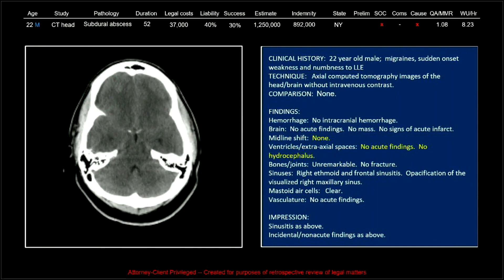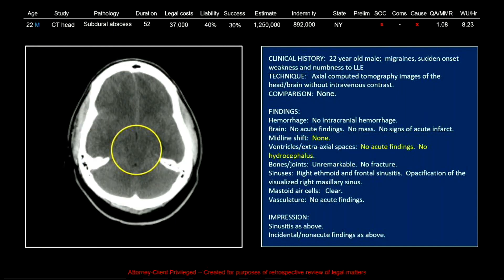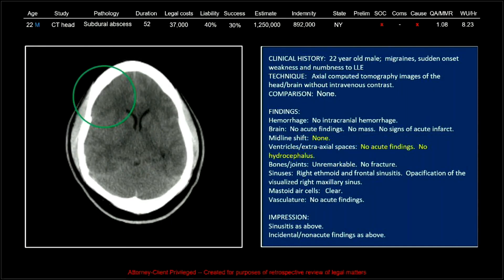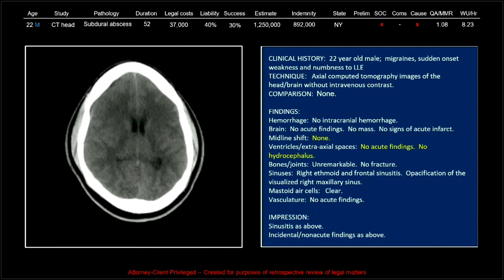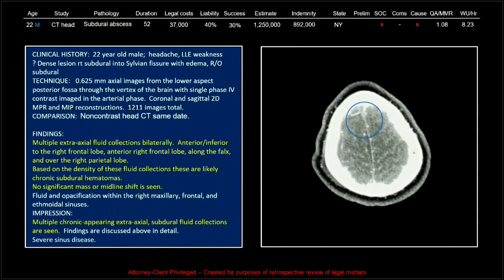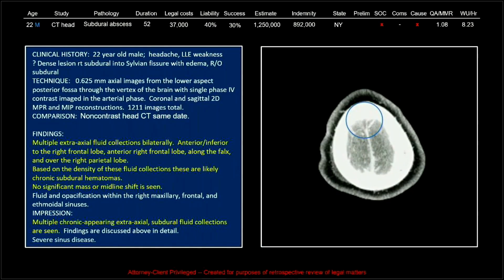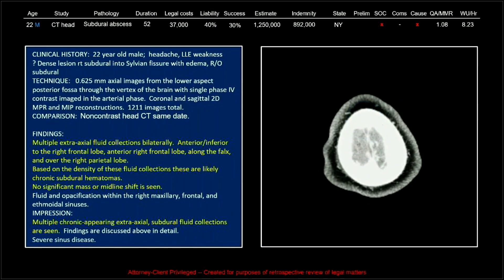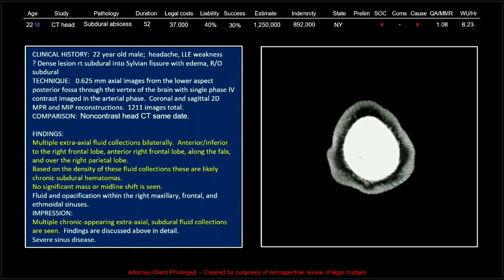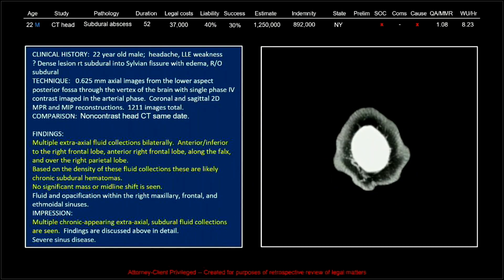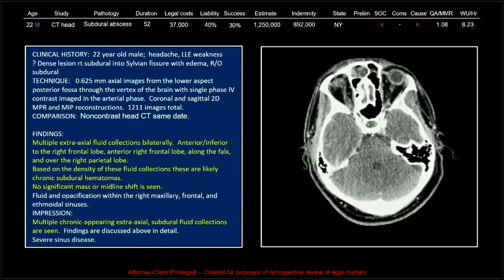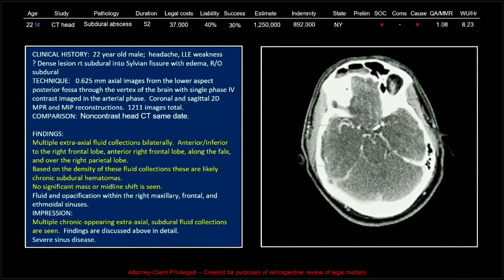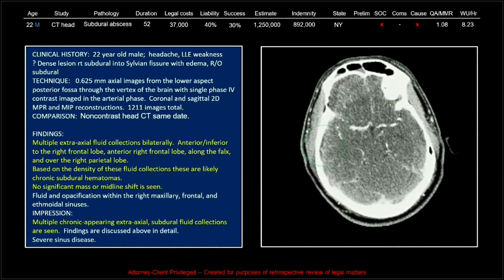So this patient came in, as you can see, with migraine, sudden onset weakness, and numbness to the left lower extremity. So they did pursue it, and they did a CTA, and you can see not only those fluid collections and the problems we previously discussed, but there's also even superior sagittal sinus thrombosis.